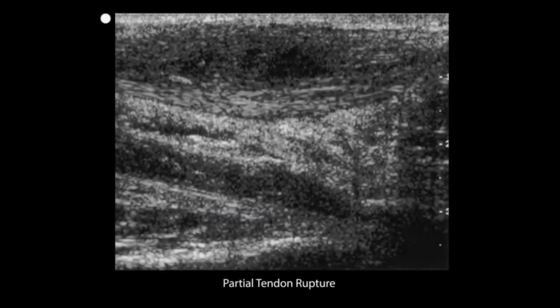Now, when someone has a partial tendon tear, the ultrasound operator should compare the respective sides of the body. The affected side should demonstrate increased tendon width. So, the tendon actually goes from here all the way over to here, and one can see that this part of the tendon is actually fine. It's not torn, but there is this hypoechoic, almost anechoic area seen here.